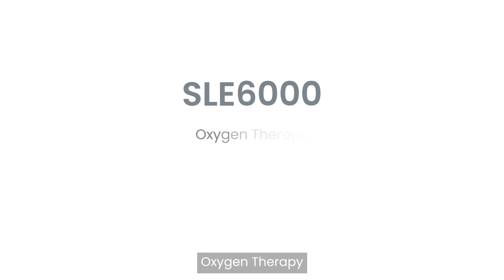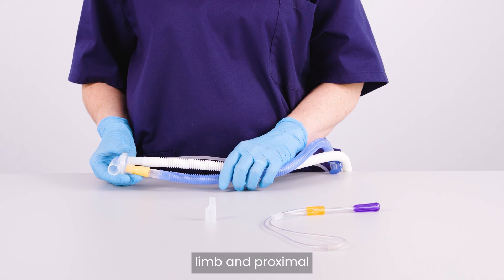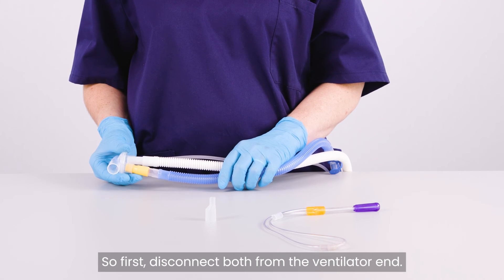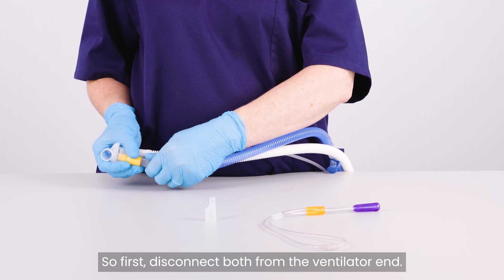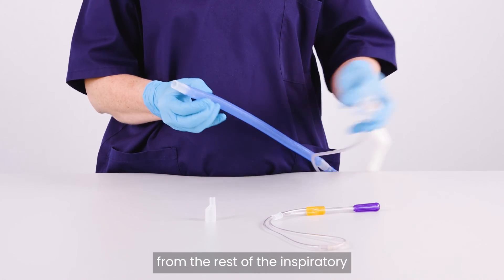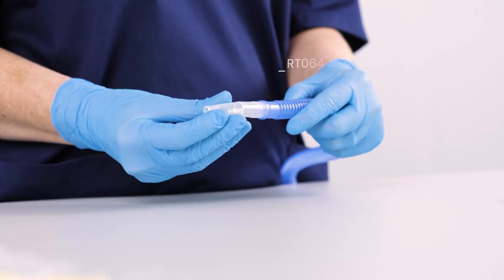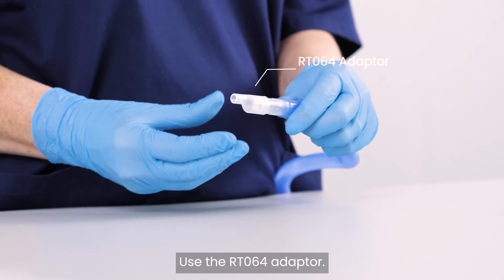In oxygen therapy mode, the expiratory limb and proximal airway tube are not used, so first disconnect both from the ventilator end. Disconnect the tube that contains the yellow restrictor from the rest of the inspiratory limb of the SLE-6000 patient circuit. Use the RT-064 adapter.